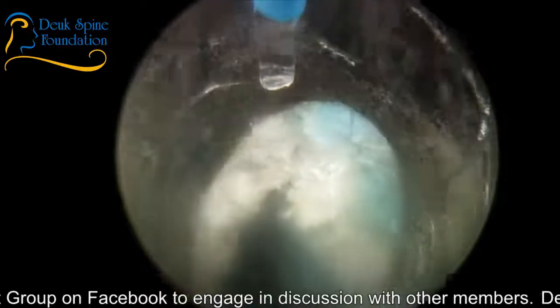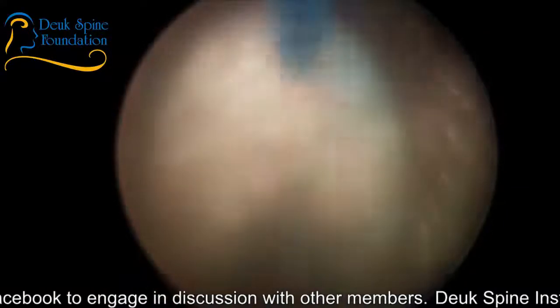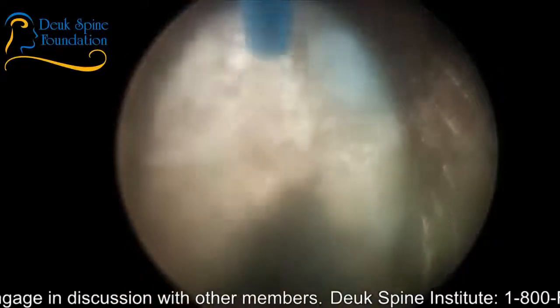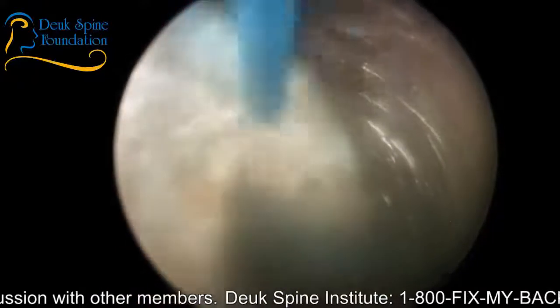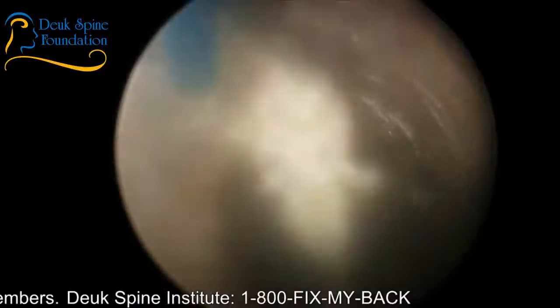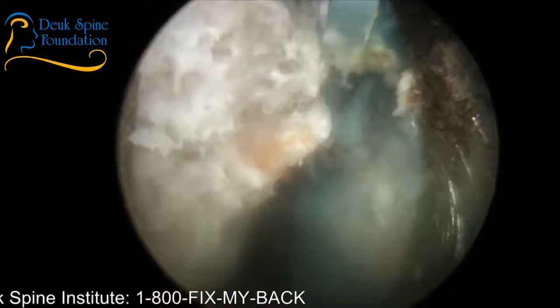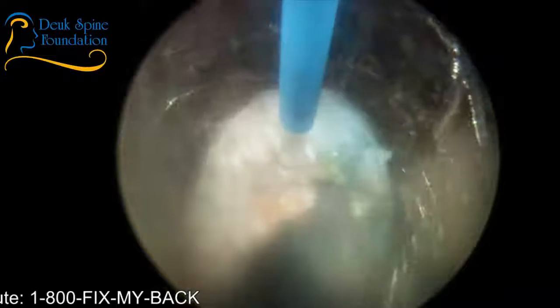And it's the annular tear that's the cause of the back pain, and most commonly the cause of the leg pain, leg symptoms. Far more often is it the annular tear causing the symptoms in the legs than compression of the nerve root by a herniated disc or a bone spur. This is a bone spur. You see, I'm about to free it up. There it goes. That bone spur was pinching the nerve in the foramen. We shoved it into the disc when I hammered that dilator in.